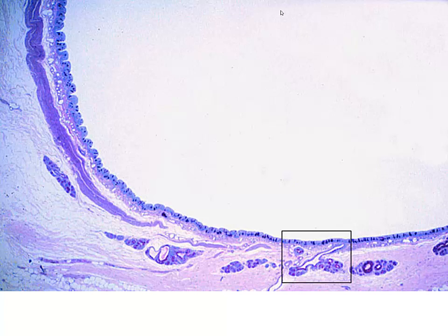Looking at a different section, different stain, as we get into our trachea, we don't see the cartilaginous rings, but we're looking at the mucosal lining, the submucosa, these glands and their ducts.